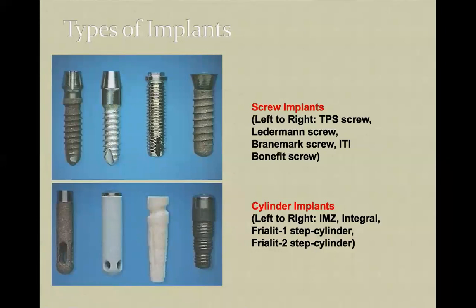And that is also very important. When you're doing a surgical procedure, you have to be ready for everything. You have to have a set of instrumentation, maybe an anesthesiological background, an emergency kit, anesthetics, electrocautery, and you have to have enough dental implants.